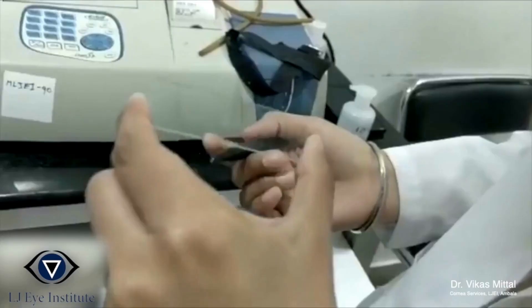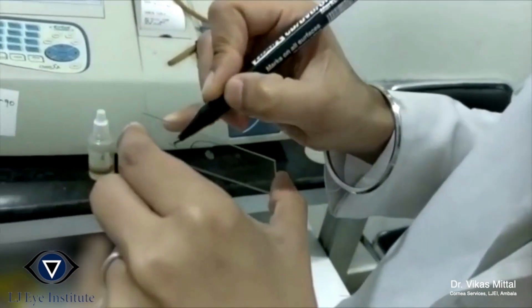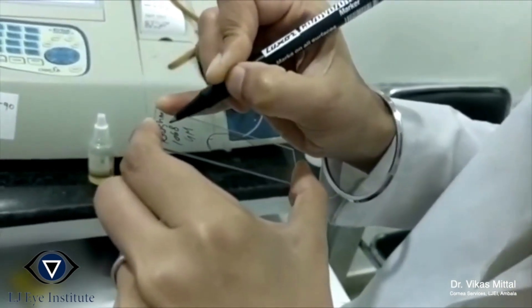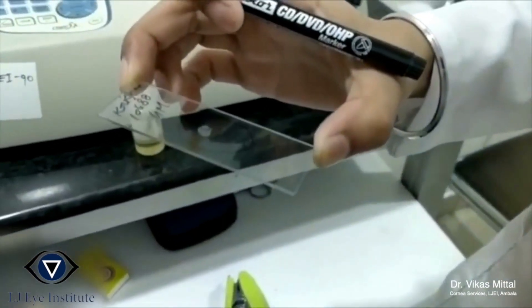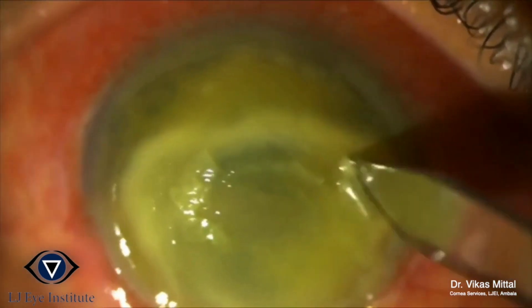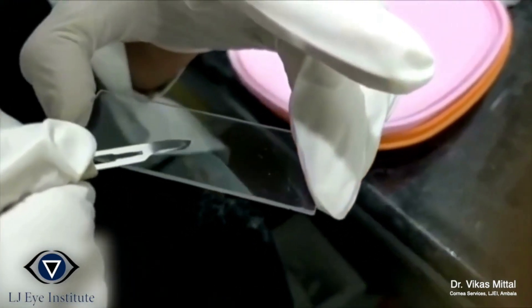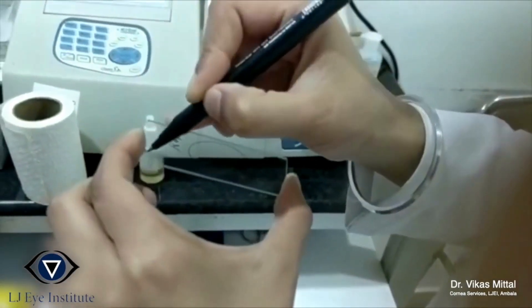The slide is labeled with the name and MRD number of the patient. For KOH, material is inoculated by tapping it on the slide, and the slide is again labeled with the MRD number and name of the patient.